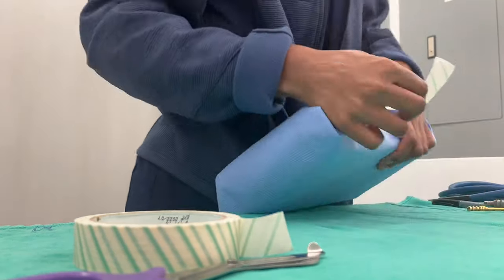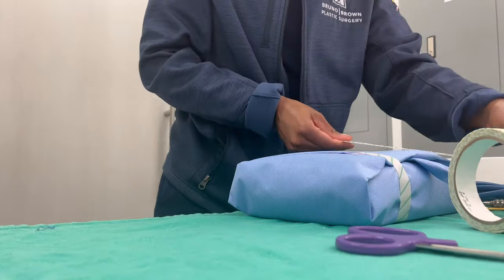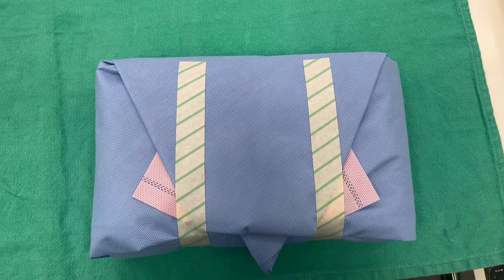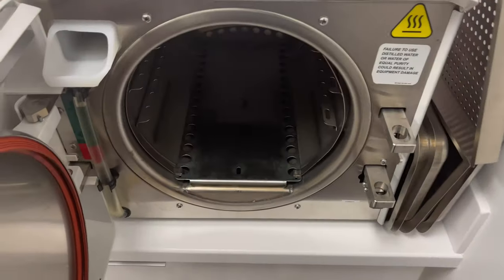So here I am just putting the indicator tape on the outside of the instrument pan. So you just want to make sure you tape down, and sometimes you can use the tape as a way of making sure it's all tight as well. So if there's any gap, you can use the tape.